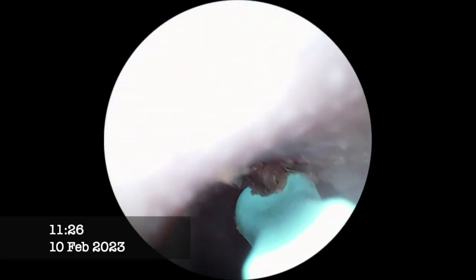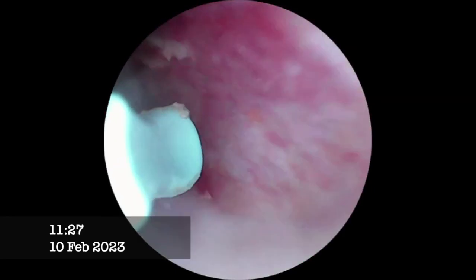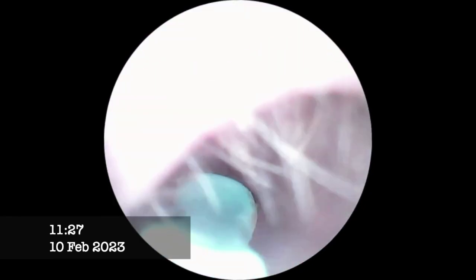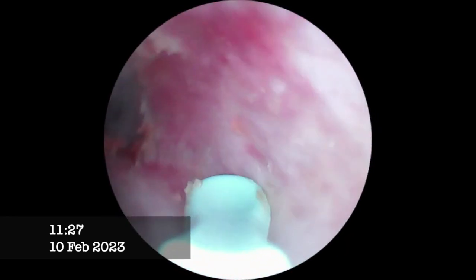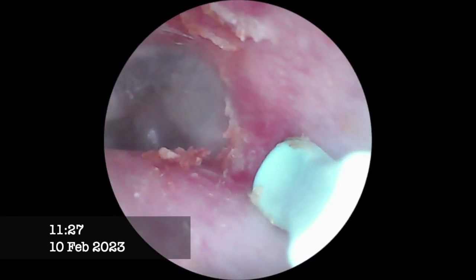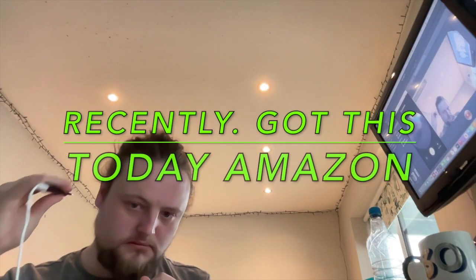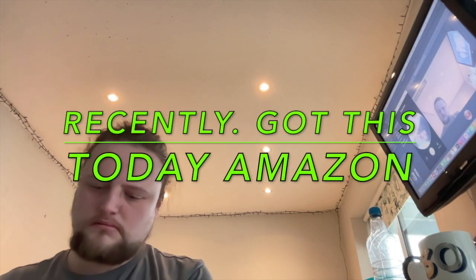The moral of the story here is that removal of earwax by an untrained professional is extremely dangerous and should never be attempted. If Heather was unable as a retired nurse practitioner to remove her own earwax using a video endoscope, what makes you think that you would be able to do it? And while it would be great if tools like this actually worked and saved you some money trying to get earwax outside of your ears, it is a much safer option to spend a little bit of money to periodically go into your hearing care professional, have them remove the earwax for you, so you can save a lot of money down the road by not having a surgery to repair your eardrum.